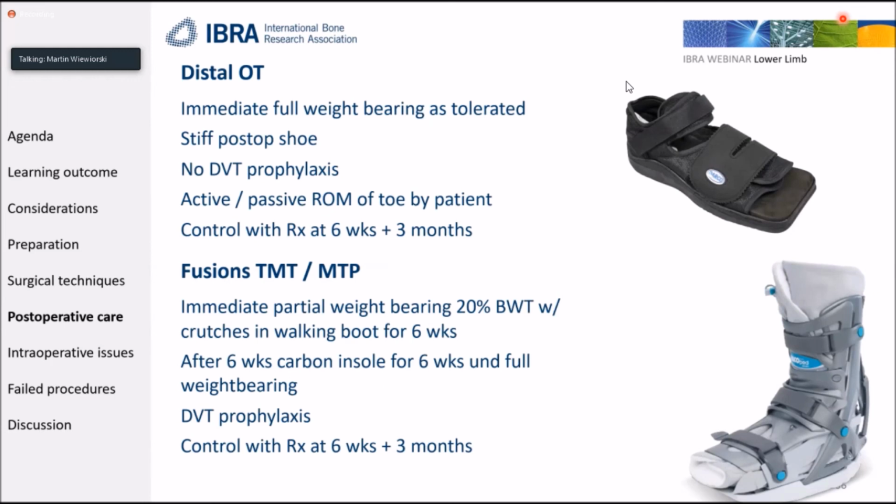For any kind of distal osteotomy, chevron or scarf osteotomy, I put the patients immediately into full weight bearing. It's tolerated. Some of them need crutches, but none of them come with crutches to my outpatient clinic after 6 weeks. I use this stiff post-op shoe. They don't require any DVT prophylaxis. And then I advise patients to start active and passive range of motion of the toe by themselves on the second day after surgery, and I usually do controls after 6 weeks and 3 months.